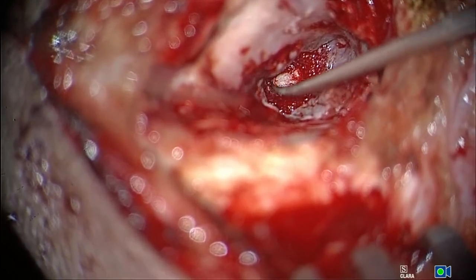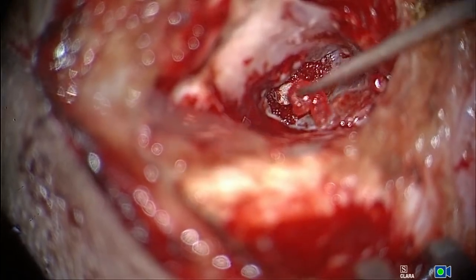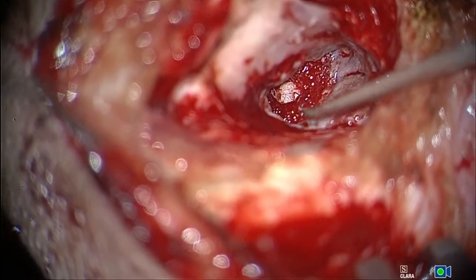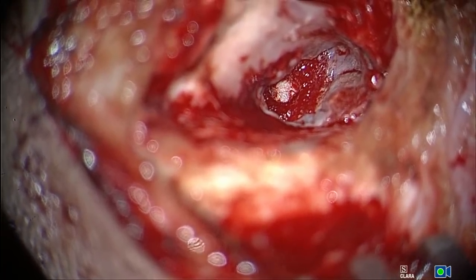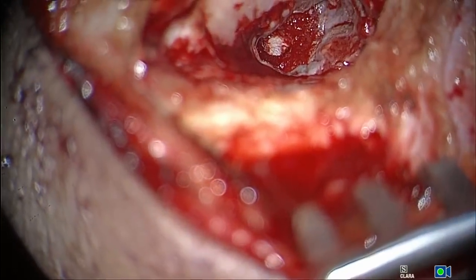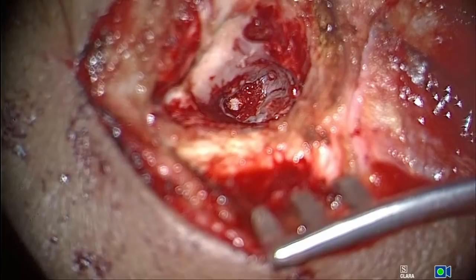I think the most important thing you have to learn here is the depth, the amount of finesse you show in your graft placement. This is the most important. Don't tear, pull, pluck, keep some cartilage, then put some perichondrium. If you put the cartilage just because you are scared that your temporalis fascia will not take properly, that is why you are putting that. Or else, there is no reason I can see why you would actually use cartilage in the middle ear.